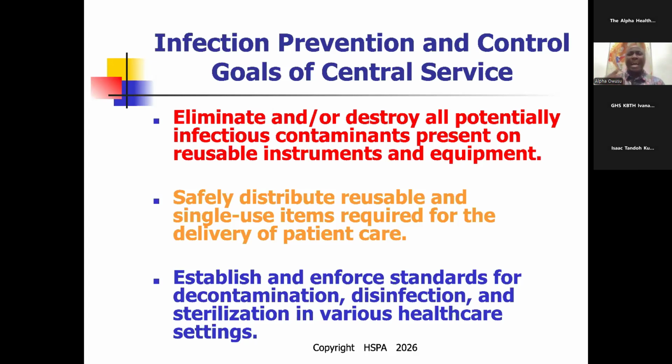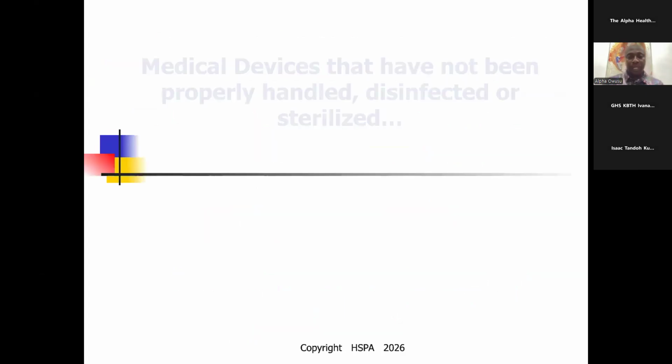When the instruments are heavily soiled, how we treat it, you spray it, the enzyme breaks the surface, and makes it easy to be clean. Very, very important. Not making it clean, you are destroying the instrument. The enzymes are broken down, right, to reduce, to kill infection, making it safe to be sterilized. Very, very important. So these are the things that infection control is looking at.